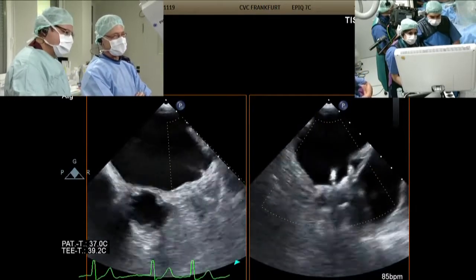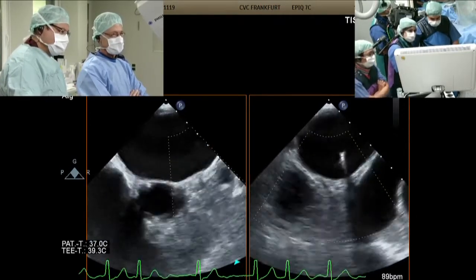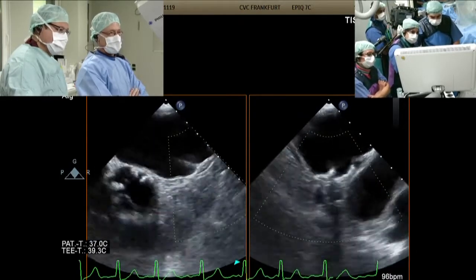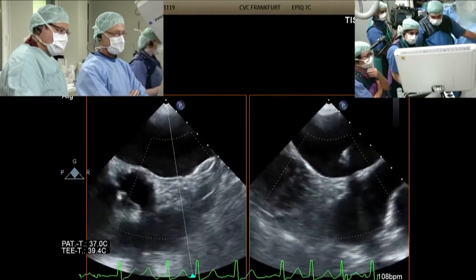Bushra, yesterday when you were talking about looking for a residual leak, you mentioned that you have to reduce the Nyquist limit. Yeah, we've done that actually. You don't have to do it, but it just helps you look for any small leaks. We're just trying to get you a 3D of this image here.